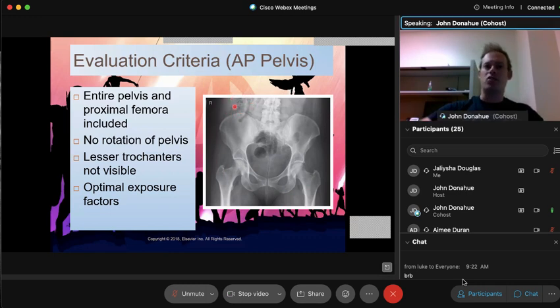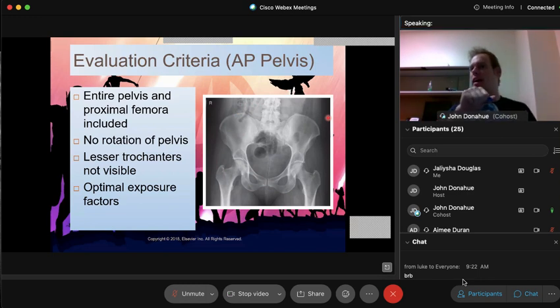If you find that iliac crest, you put two fingers on top of that crest, put the top of your light above those two fingers, you're going to get a centered x-ray just like this film right here. I mean, it works beautifully. It's a wonderful way to center for those pelvis x-rays. Works like a charm. Just make sure you know the actual central ray location. Don't write my method on the test. That's not in the book. That's just my recommendation.